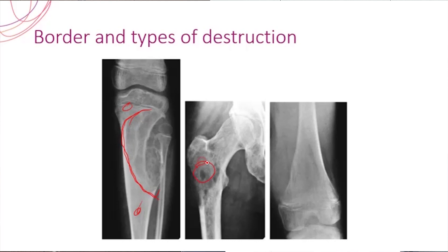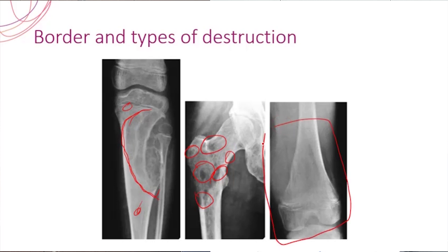Here you could see multiple moth-eaten-like appearances, and these show that this may not be benign — the possibility of being malignant is quite high. And if you look into this area, there is something pathological running but you cannot say exactly where it is all happening. Approximately, things are going wrong somewhere in the metaphysis, but you cannot delineate the tumor very clearly. So this is what is called a permeative border — the third type, where the chance of being malignant is very high.